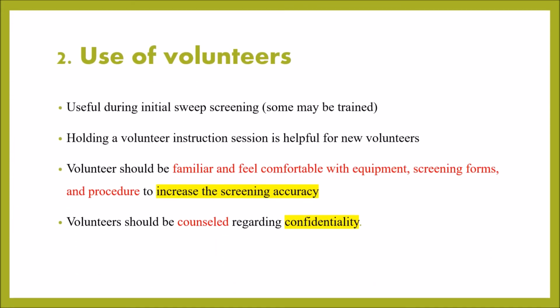Next, we come to the use of volunteers. It is not necessarily that the audiologist is the only one who can perform the screening test, but volunteers are also useful during initial screening. But they need to be trained before they perform the screening test. Volunteers should be familiar and feel comfortable with equipment, screening forms, and procedure to increase the screening accuracy. They also should be counseled regarding confidentiality.